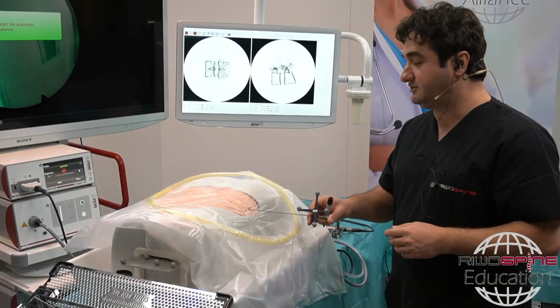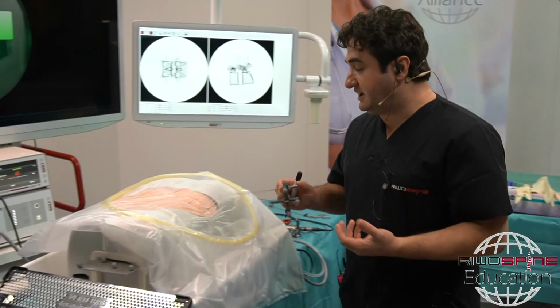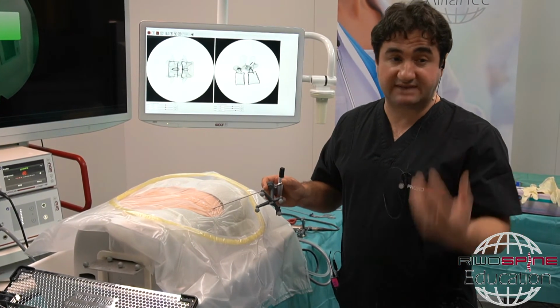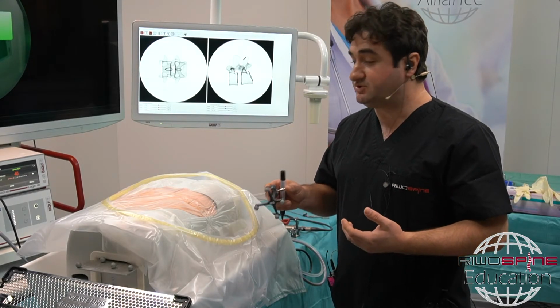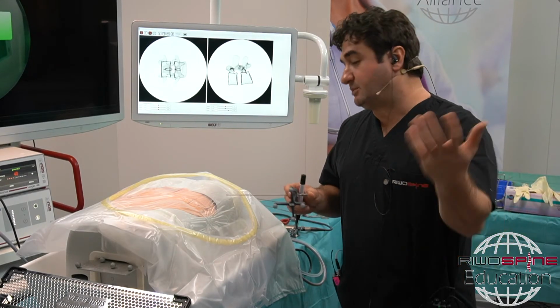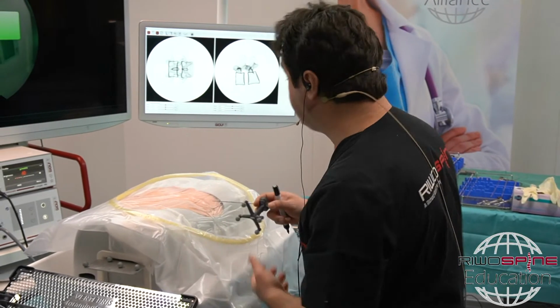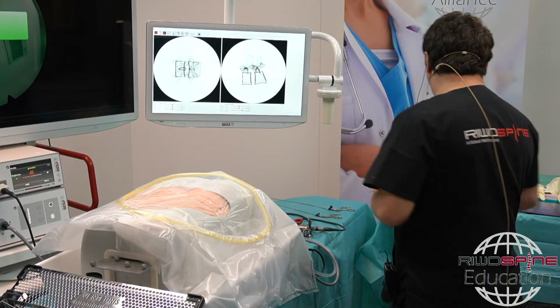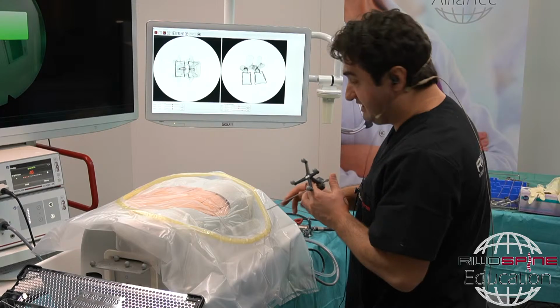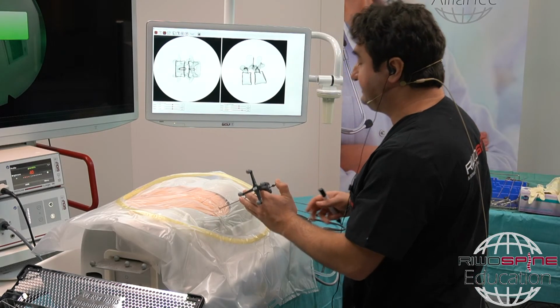As I told you, you can choose your entry point according to your pathology. If it is more central, or if you want to do an extraforaminal approach, it's better to choose maximum laterally, but otherwise for the paramedian herniations or pathologies, you can choose the green line or between those two lines. The next step is the incision. A 0.5 centimeter incision usually is enough. Then we continue with the needle placement.